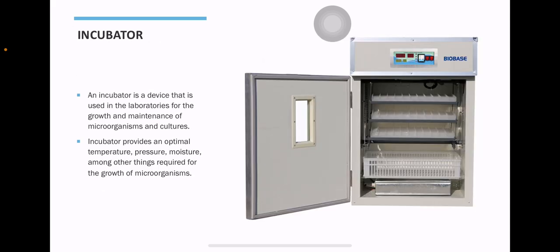Next, we have the incubator. Incubators provide controlled temperature, humidity, and atmospheric conditions. So they allow microorganisms to grow at optimal conditions, usually 35 to 37 degrees Celsius for clinical bacteria. So think of your incubator as a bacterial baby crib.